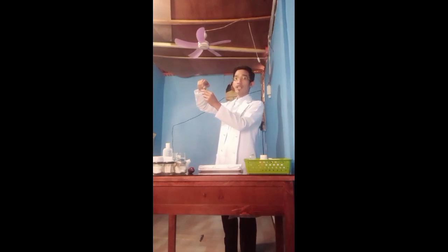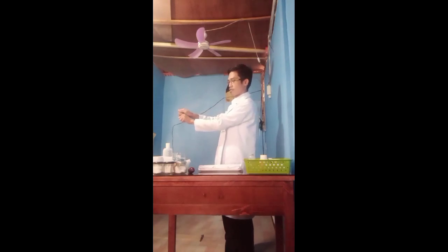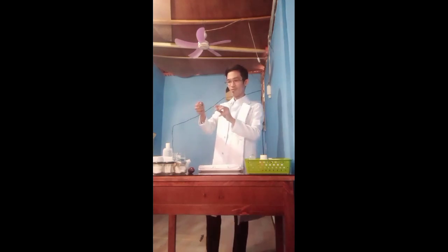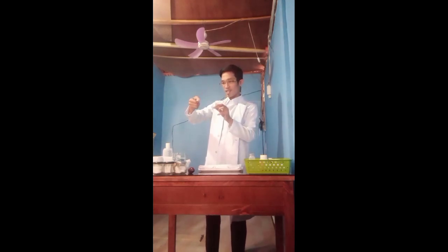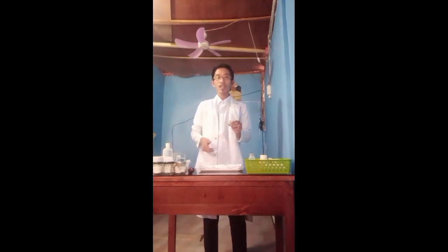So draw up medication quickly using a needle long enough to reach the bottom of the ampule. So in breaking this, just make sure that you are avoiding injuries after doing this one. Oh my god, it's perfect. So put it in the, what they call this one, the waste receptacles. So to avoid contaminating the ampule.